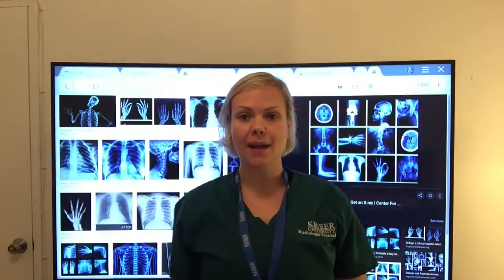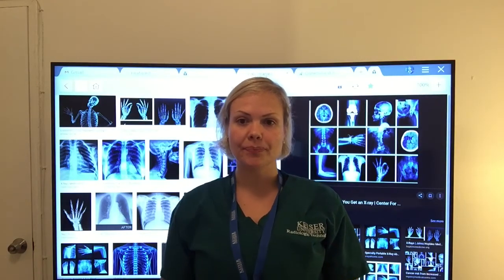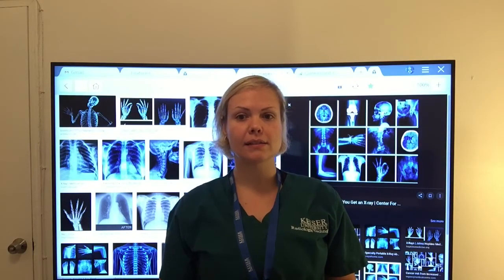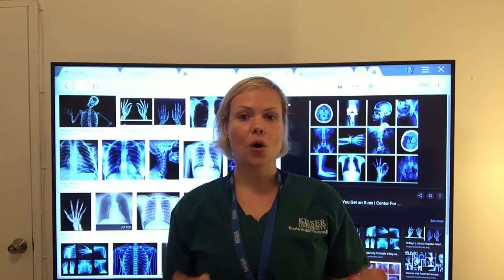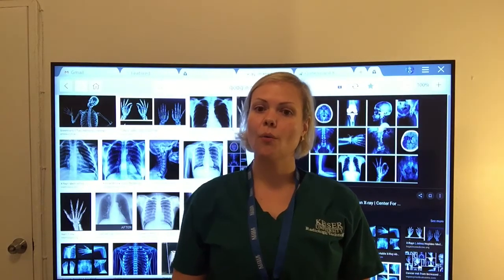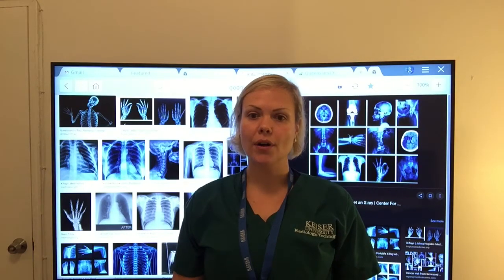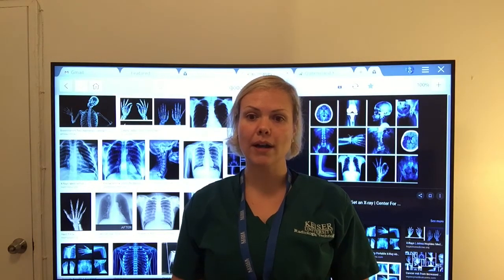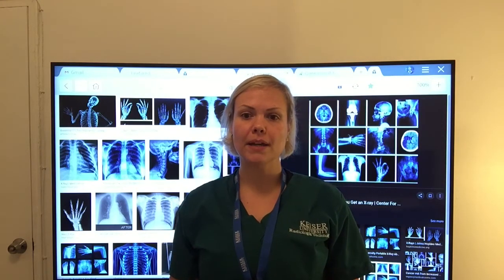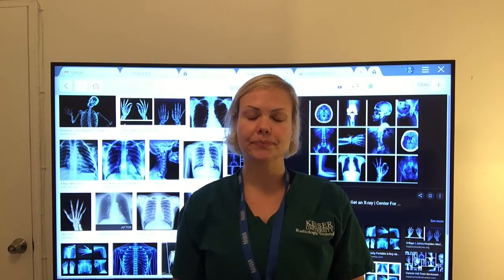Minimum response time is the shortest time of exposure that the system can generate. The minimum response time is often longer with an AEC system than with other classifications of radiographic timers. One of the implications of minimum response time is that if more time than required is needed to end the projected exposure, there will be an increased amount of radiation getting to the image receptor.